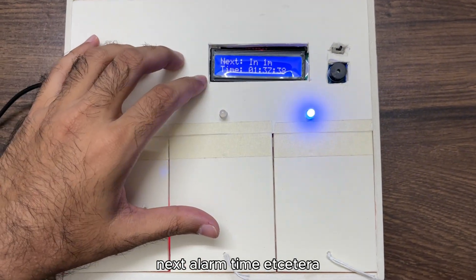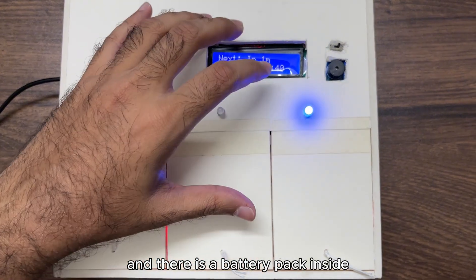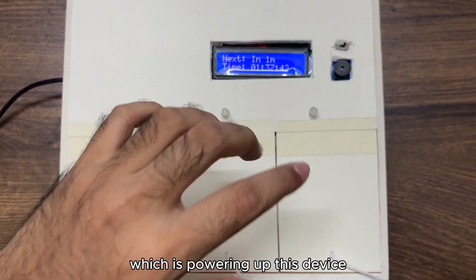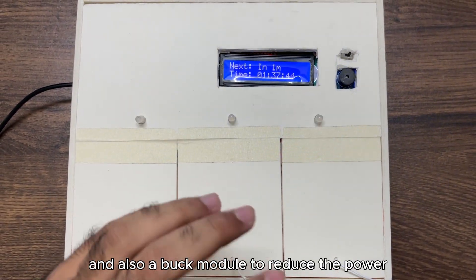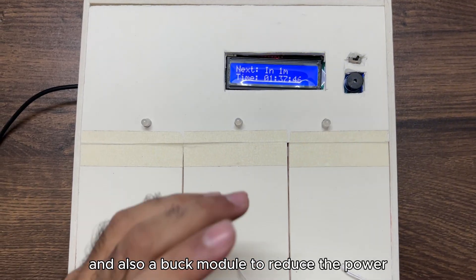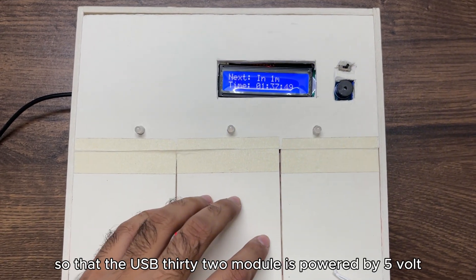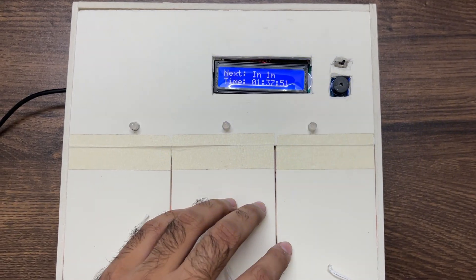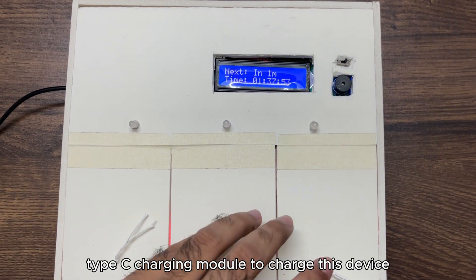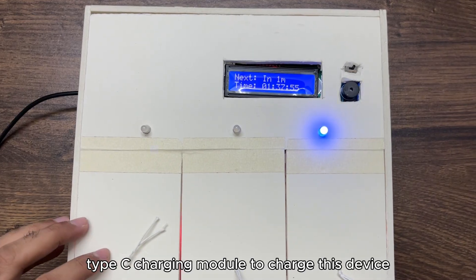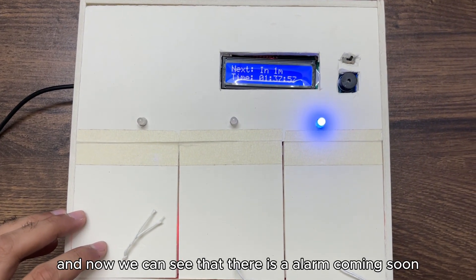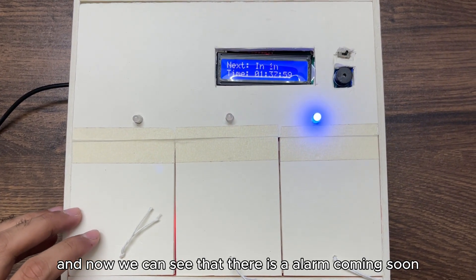There is a battery pack inside which is powering up this device, and also a buck module to reduce the power so that the ESP32 module is powered by 5 volts. There is a Type-C charging module to charge this device. Now we can see that there is an alarm coming soon.